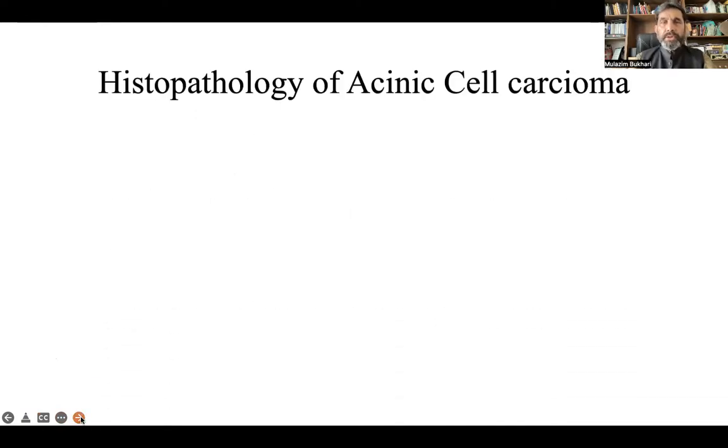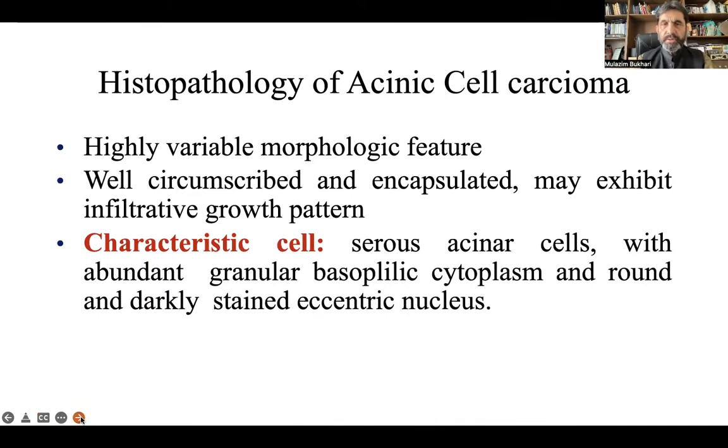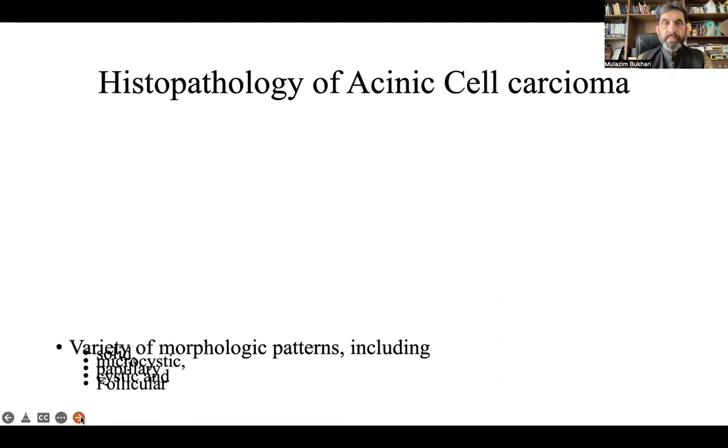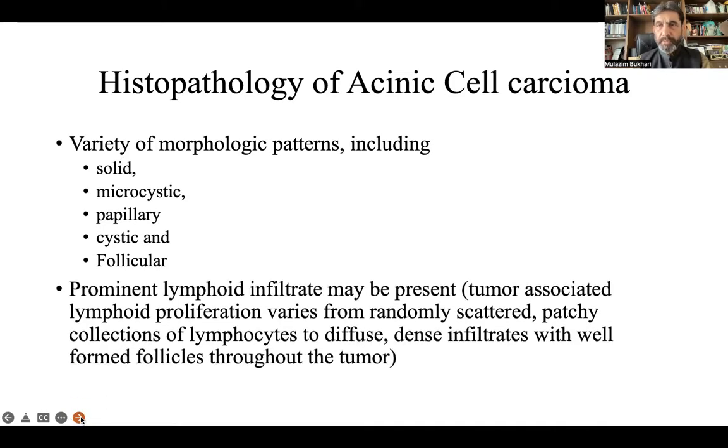So histopathology, as we have discussed: high power views show encapsulated tumor with characteristic cytoplasmic basophilic granules. Depending upon the grades, mitosis may or may not be there. There are 4 to 5 patterns: solid, microcystic, papillary cystic, and follicular regions, which sometimes may confuse with metastasis from the thyroid, especially when it is in the submandibular gland.